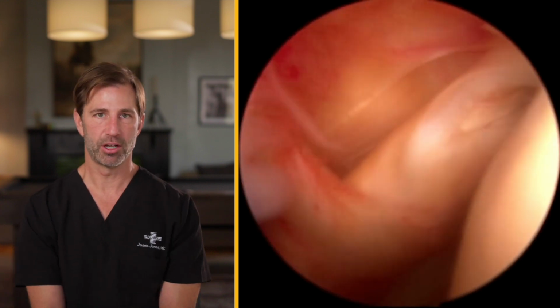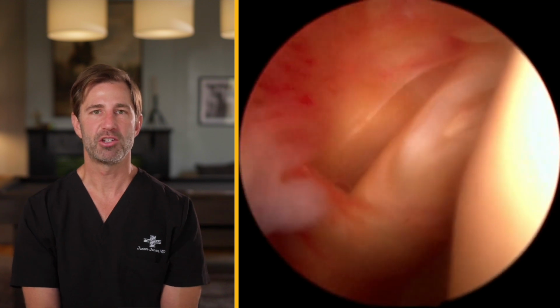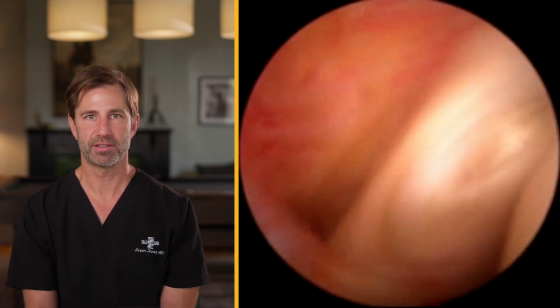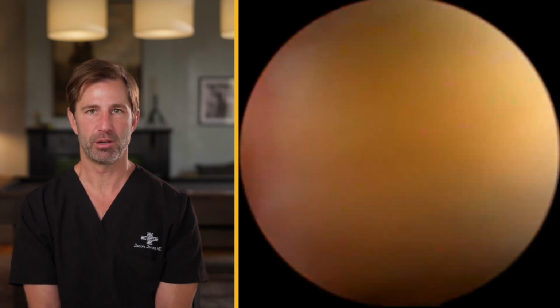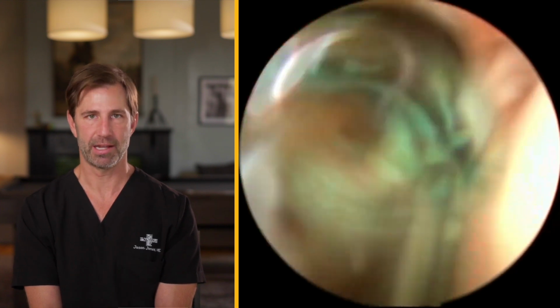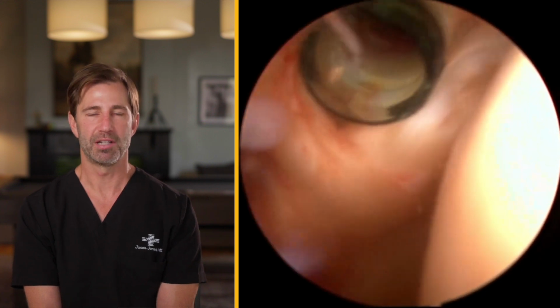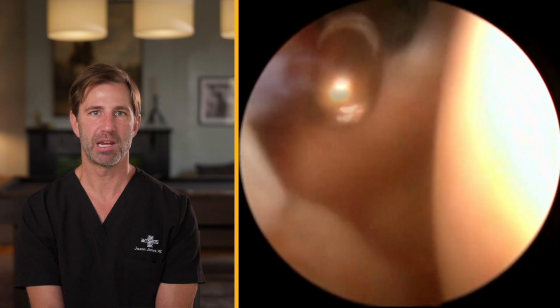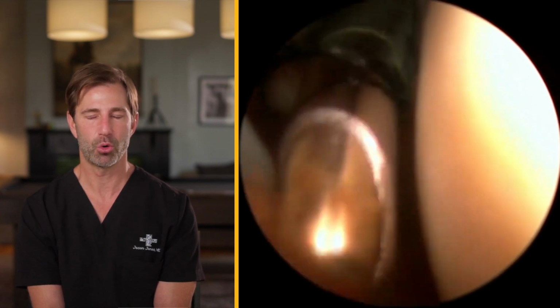In this particular video, we've already positioned the patient. What that means is we're putting the patient in the ideal setting in order to allow access to the joint in order to fix his problem. I tend to do these cases in what's called a beach chair position. This is a funny name, but the patient is sitting up, slightly reclined, like he's at the beach, sitting in a lounge chair. What this does is allow us access to the back of the shoulder, and there's a small portion of the table that'll slide over and allow us to position our equipment through the back of the shoulder.